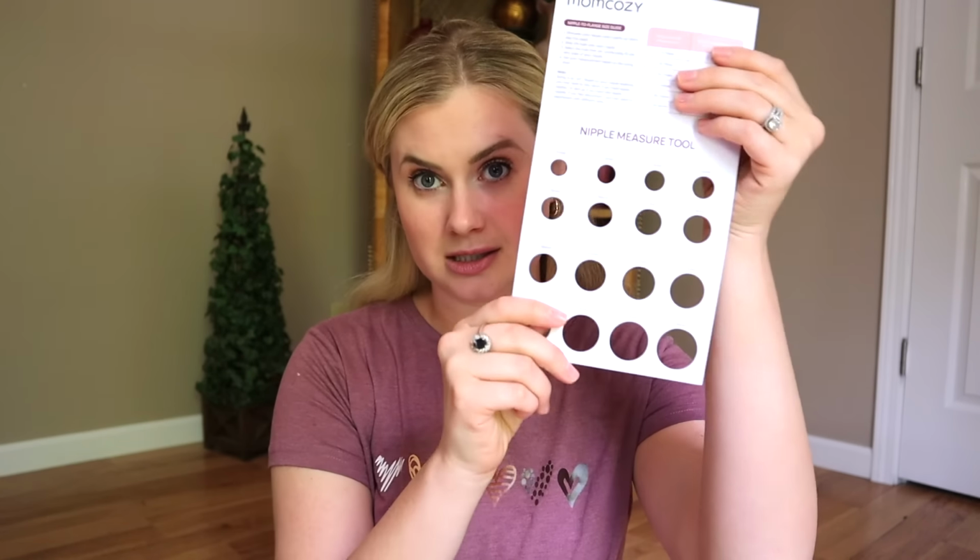Inserts can totally make or break your output. You really want to have a nice insert. It can also decrease pain. If you're having some sort of pain, maybe try to make sure you're using the correct insert. If like your areola is being pulled into the pump, then you're probably needing a smaller insert. If your nipple is rubbing along the side, you probably need a bigger insert. So lactation consultants can help with that, but these are really helpful. And remember to stimulate before you measure yourself.